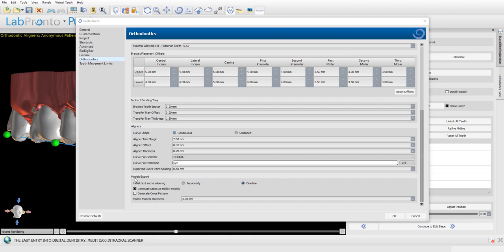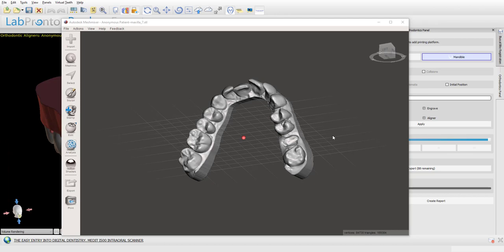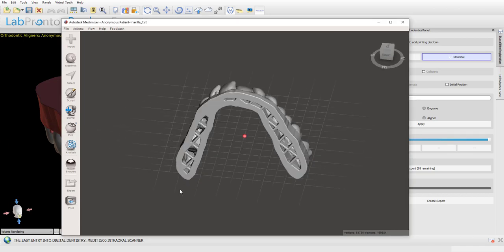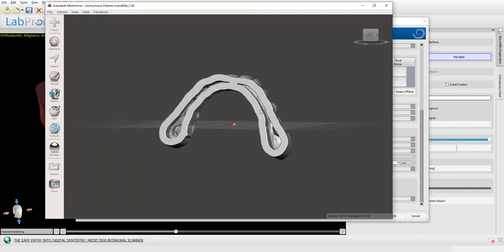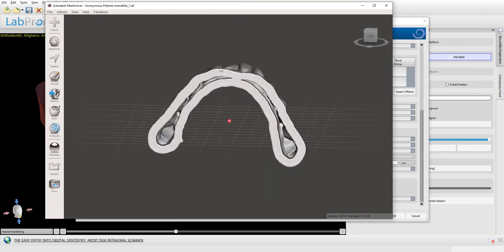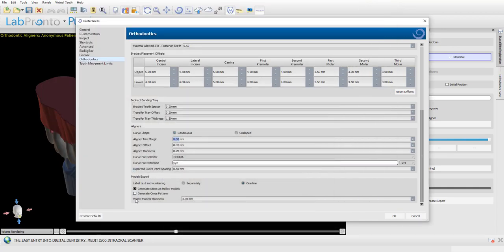The next group of settings is for model export — for situations where you're exporting models to create thermoform aligners. You have checkboxes to create hollow models. A hollow model reduces printing material and printing time, so it's generally recommended to generate models as hollow. You also have the option of generating a cross pattern on the bottom surface of the model. If you turn off the cross pattern setting, you still get the hollow model — just without the cross grid on the bottom.